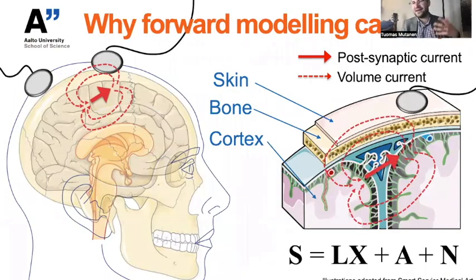Luckily, there are some aspects of the physics and physiology that actually end up helping us to remove the noise. Namely, we know very well that the neuronal EEG signals are coming from the post-synaptic currents under the skull. And because of the conductive properties of the skull and the scalp and the electromagnetic properties of the post-synaptic currents, we know that these brain sources produce voltage patterns on the scalp that are rather smeared and spread out. And this can be very different from noise and artifact signals, as we will see just in a minute.